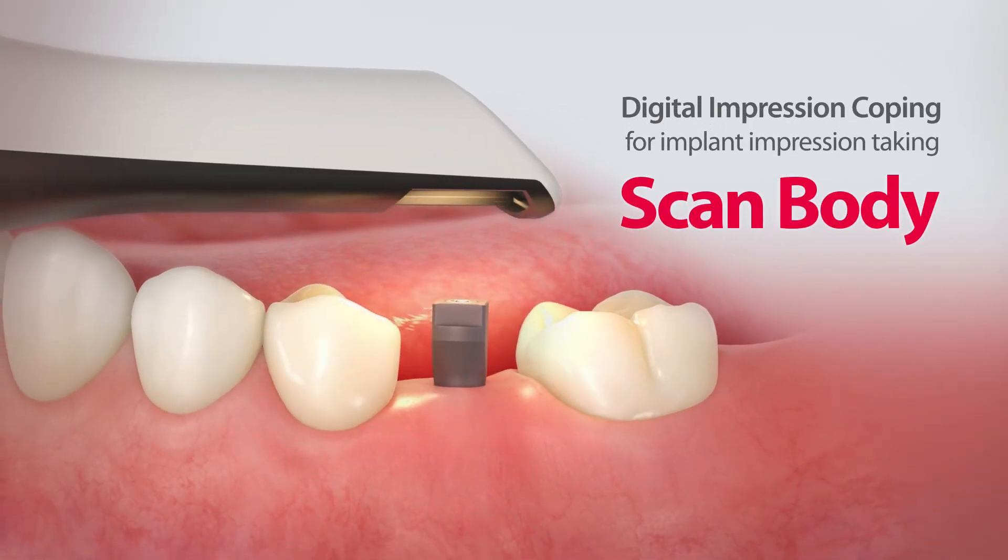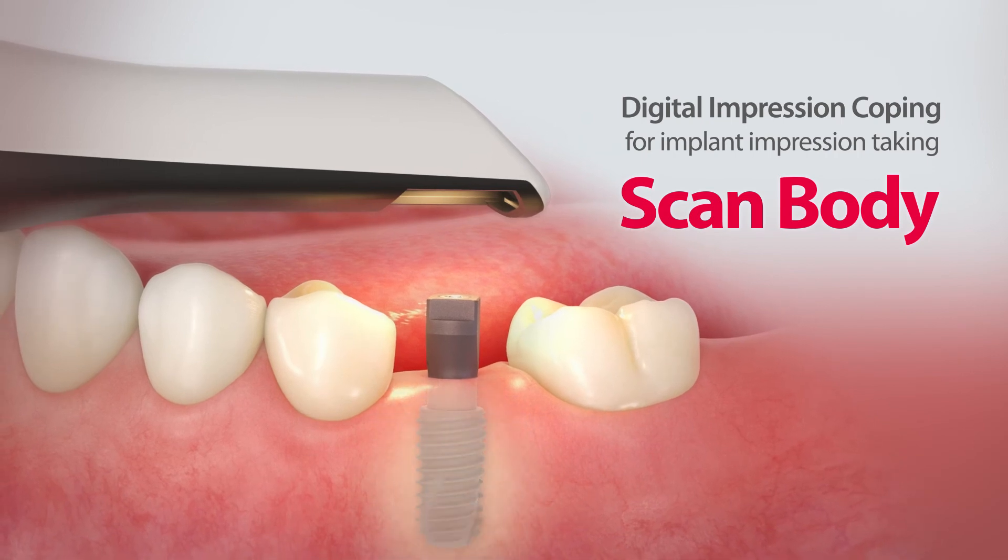Use the ScanBody for an easy and accurate implant impression taking experience.